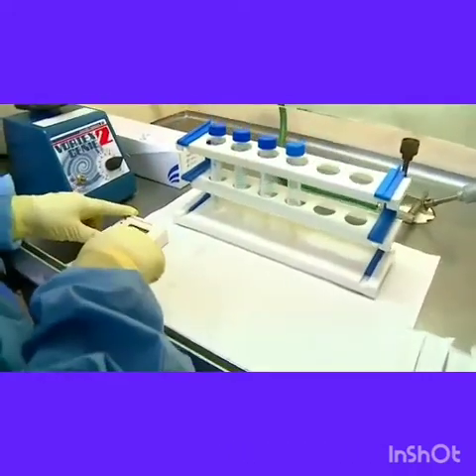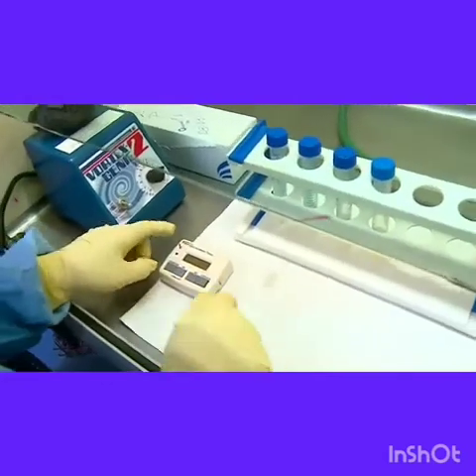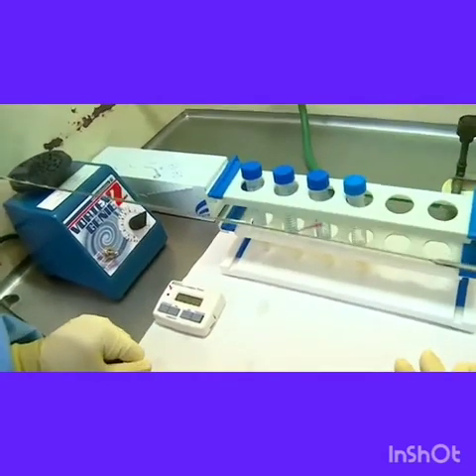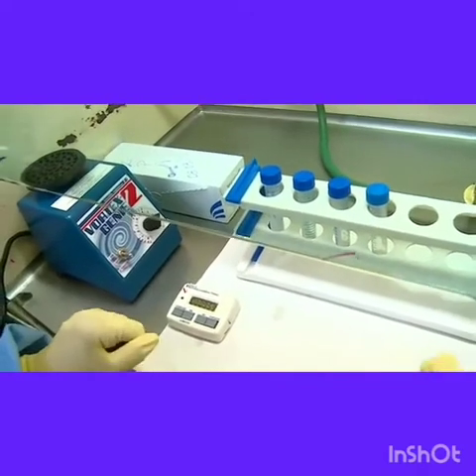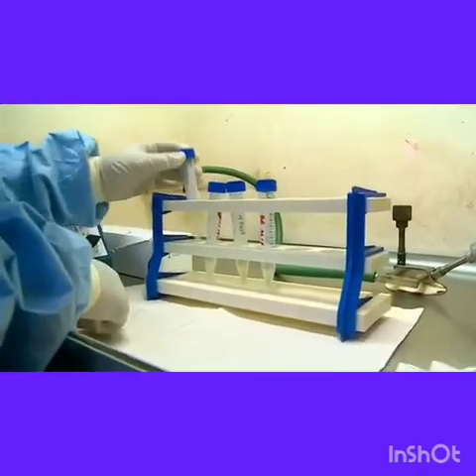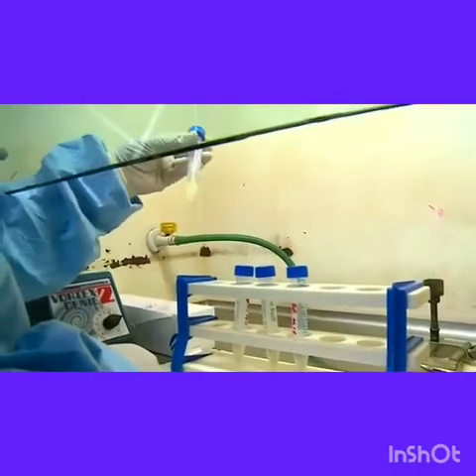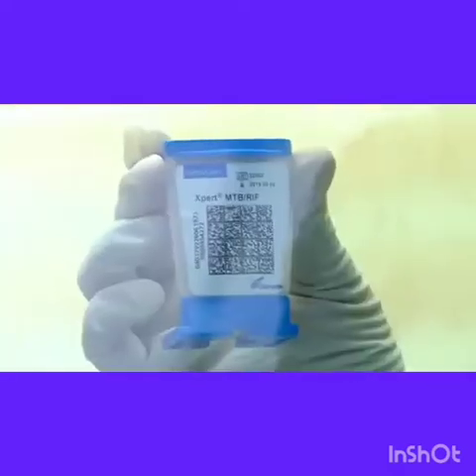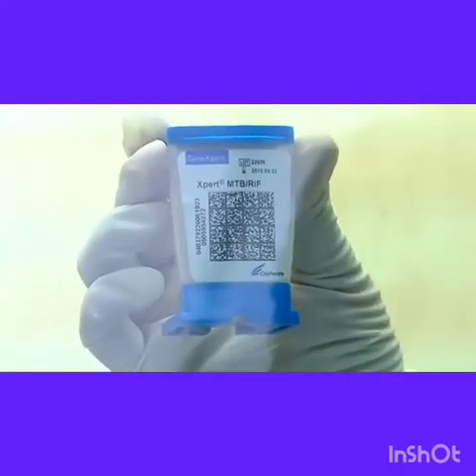After completion of all the samples, the tubes are left to stand at room temperature for 10 minutes with intermittent viewing to see whether the sample has homogenized completely. At the end of 10 minutes, the tubes are visualized to see if any more mucus particles are left, and then it is left for another 5 minutes.